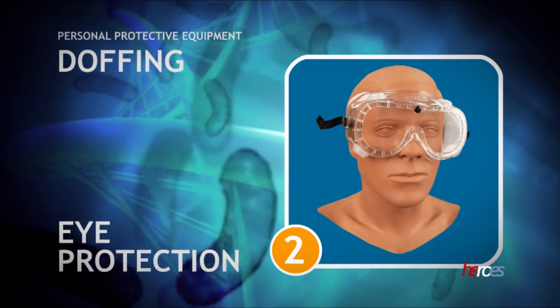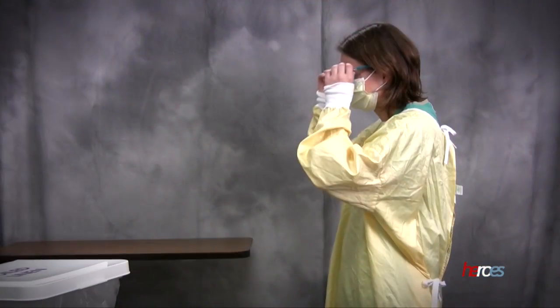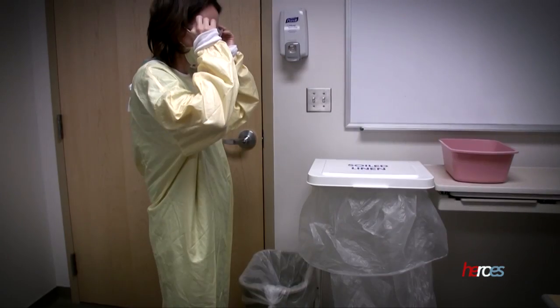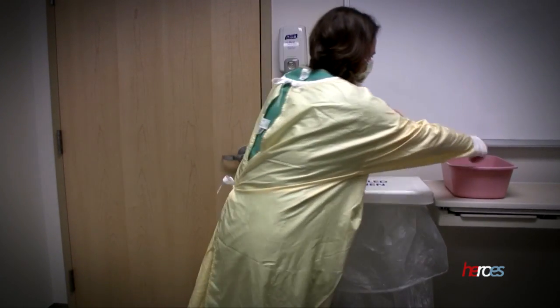The second step in this procedure is to remove your eye protection. The glasses or goggles are contaminated on the outside, so touch only the ear pieces or elastic bands while removing them. Eye protection should be placed in the trash or be placed in a designated area for reprocessing.